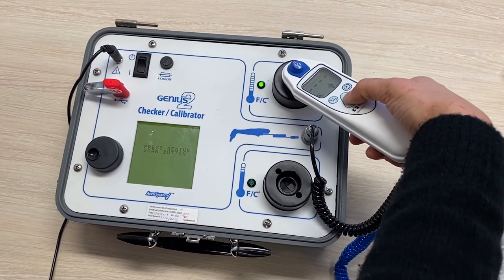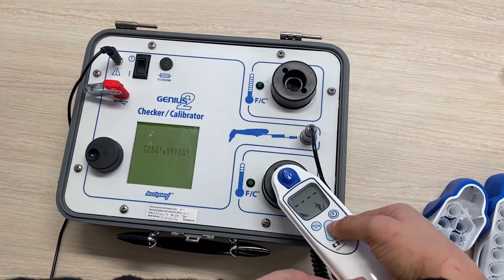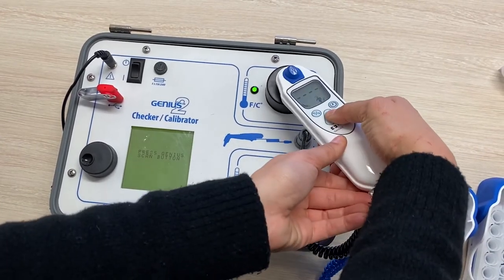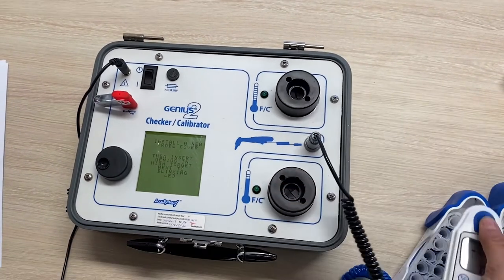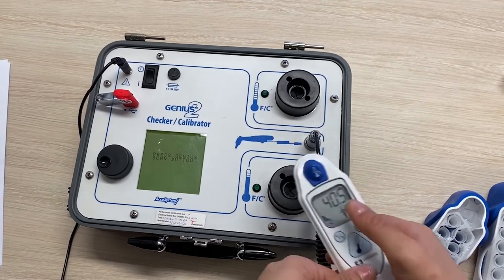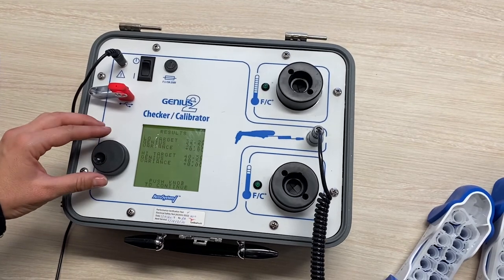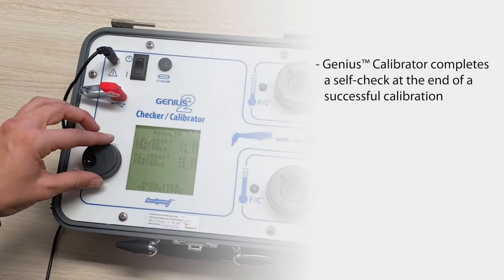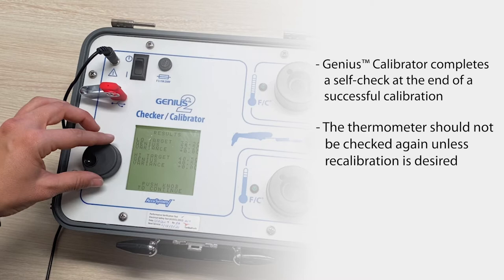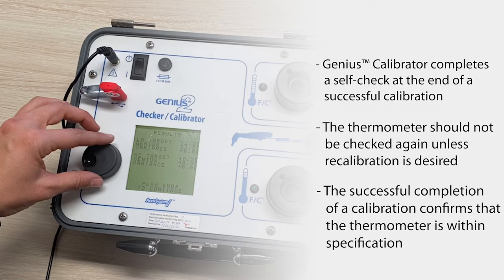So we're going a second time now. And we have now passed calibration. Here again, you can see the variance, and it is acceptable and within accuracy. When completing a calibration, the Genius Calibrator does a self-check at the end, so you can be assured that the thermometer is tightly calibrated. The thermometer should not be checked again unless a recalibration is desired. The successful completion of a calibration confirms that the thermometer is within specifications.